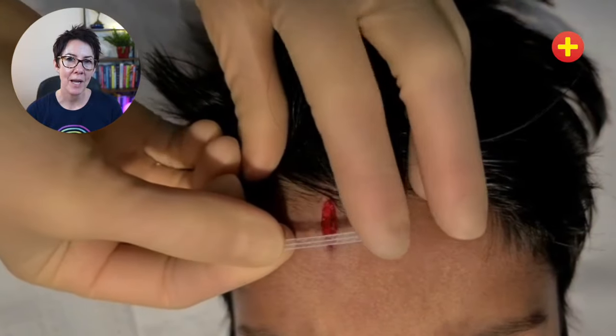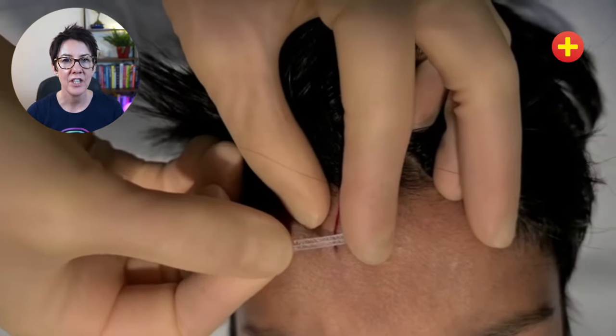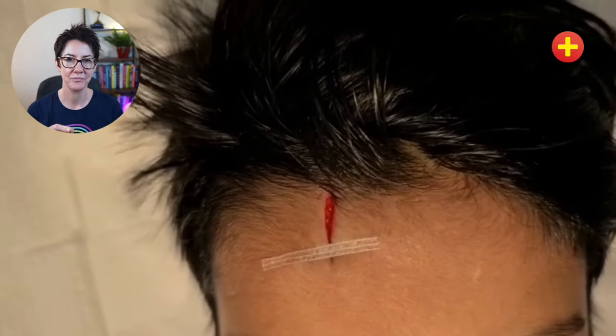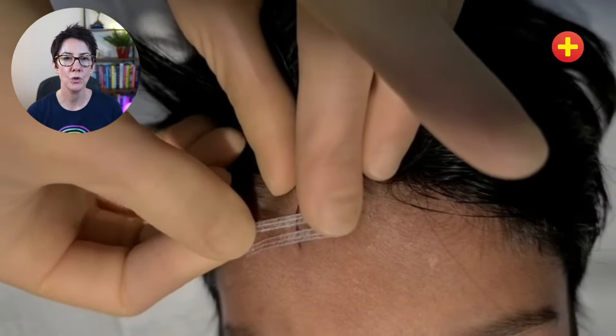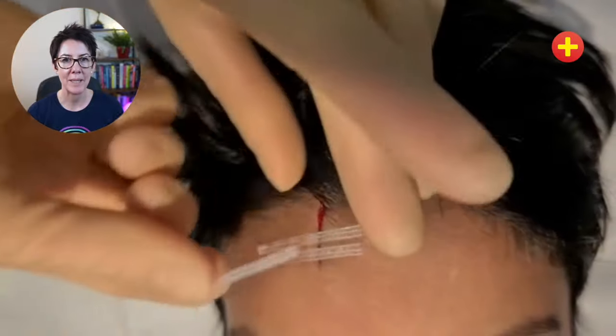Bring each strip up to the very edge of one side of the wound and then use the strip to pull the wound closed, bringing the other side of the wound into position with your finger. Depending on the shape of the wound it may be easier to start either at one end or in the middle, and you're going to place the strips two or three millimeters apart.